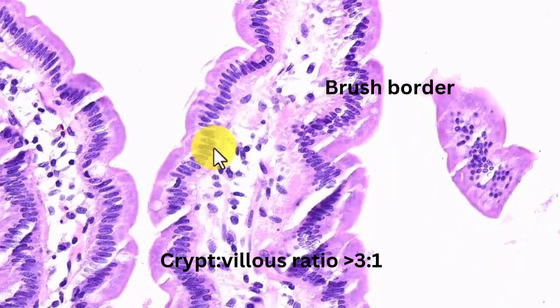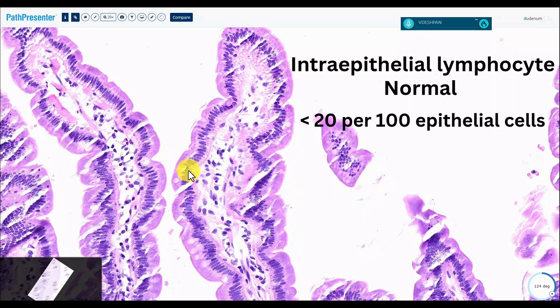You will see scattered lymphocytes — here's one, a dark cell, and here's another. Normally you should be seeing less than 20 lymphocytes per 100 epithelial cells, which translates into one lymphocyte per five epithelial cells. When it crosses 25, that is abnormal, and that gets into the spectrum of celiac disease, though there are many other conditions that cause an increase in intraepithelial lymphocytes.